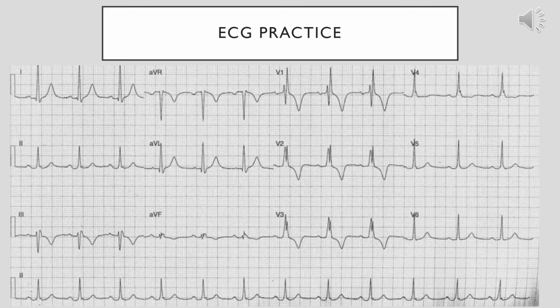Now, looking at the ventricular leads, we start to notice this bunny ear pattern that we sometimes see with bundle branch blocks. And it looks like we could have that going on here. Looking at V1, 2, and 3, we can definitely see that right bundle branch pattern. We also see a deep T wave inversion, which can be disheartening, over here on lead 3. So we've got a deep T wave on 3. The first 3 ventricular leads have that finding that looks like right bundle branch block to me.